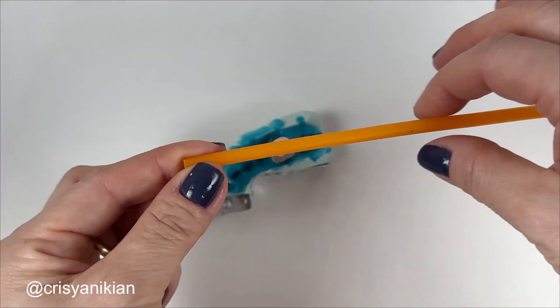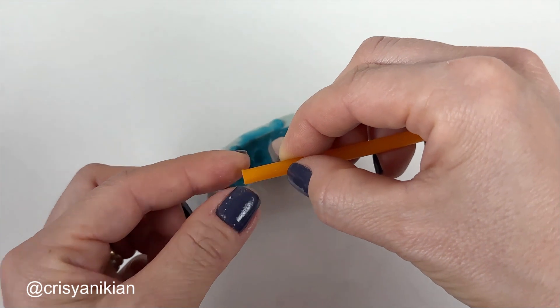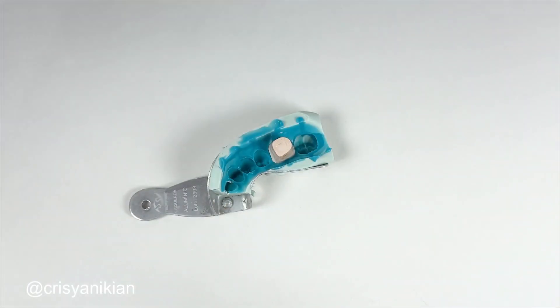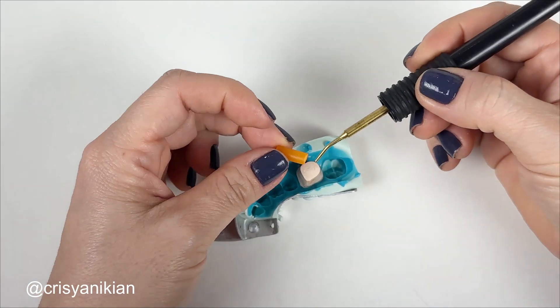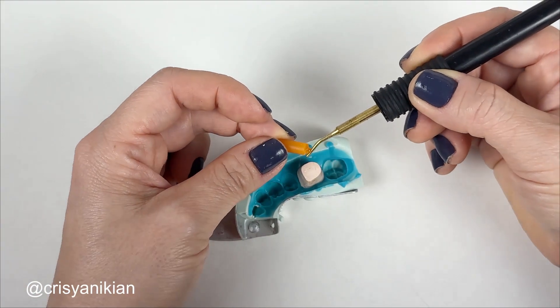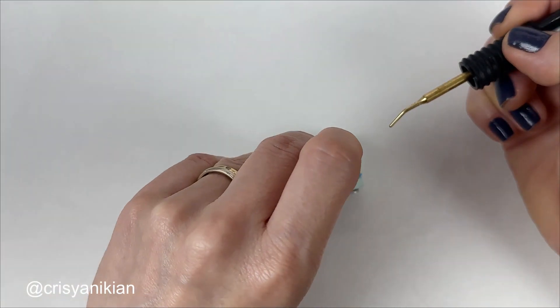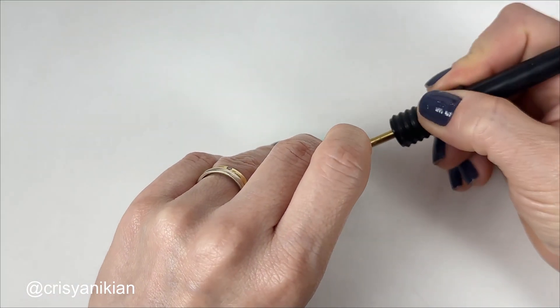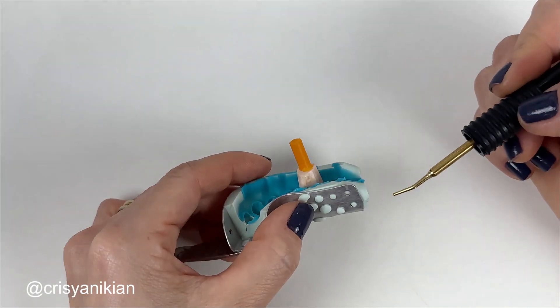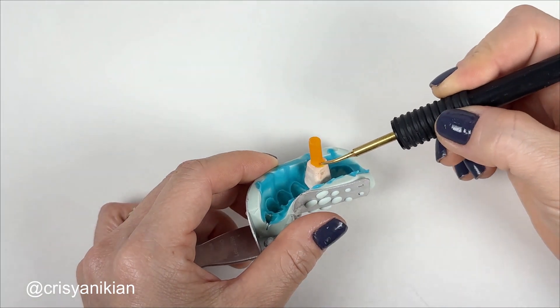Take a five-millimeter diameter wax stick and cut it in a portion of approximately three centimeters. Use the hot dropper to plasticize the wax at the stick space and join it to the bottom of the die. Then plasticize the wax around the stick to make it more stable.